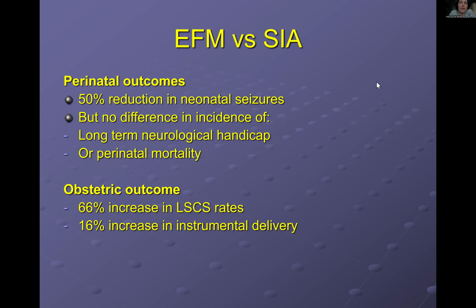You have more machines which are more accurate. So our role is to be able to interpret it better, so that we intervene when needed but don't over-intervene, because over-intervening means more cesarean sections and instrumental deliveries.